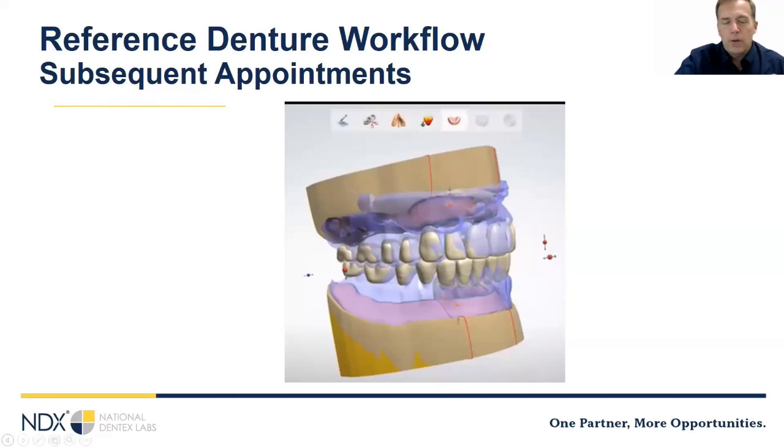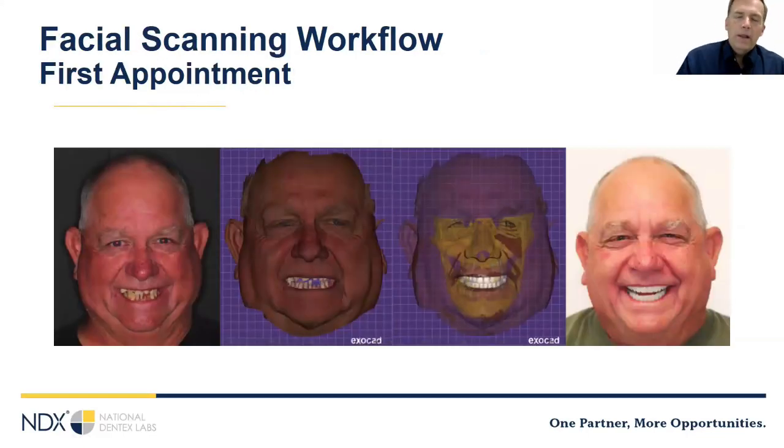Now I'll talk about a couple of more unusual workflows, I guess I'd say. One of the things that I think is different between clinical dentistry and laboratory dentistry is that you get to see the patients every day. And so you look at things and you're like, well, that doesn't look very good in the patient's mouth. But many times for us laboratories, we don't get to see the parts of the face that are really important for our teeth. We don't get to see the lips. We don't get to see the nose, the chin, the eyes. So you do your best to give us something that represents those things.